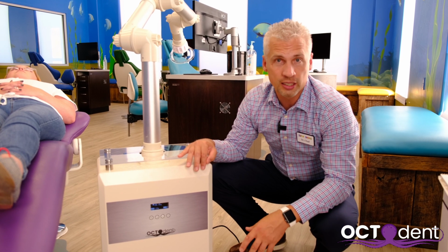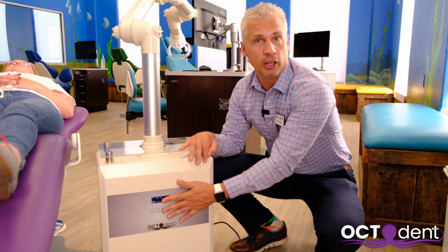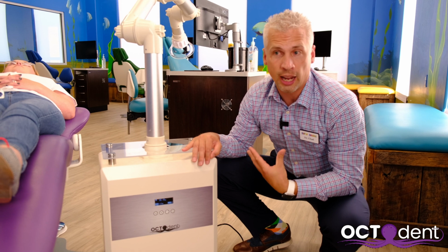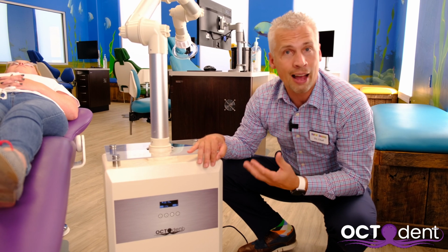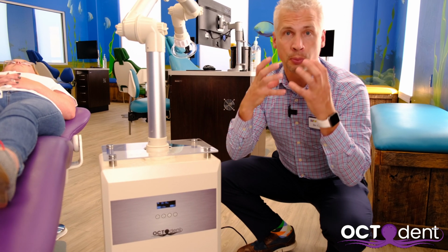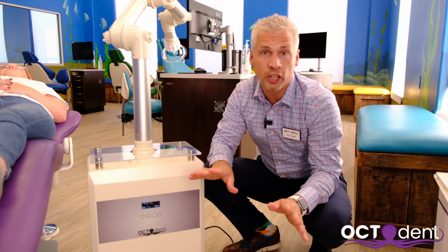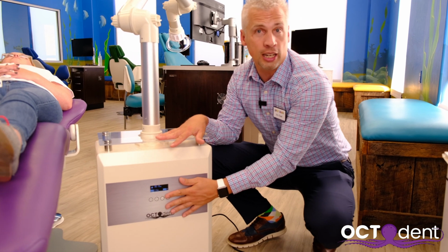The reason being is that if it's closely adapted to the patient's face, 4 is going to be enough. So if I'm a single operator, or I'm just doing air polishing or Cavitron, and I'm able to position it really easily next to the patient's face, I have a patient who's very compliant, they aren't moving around a lot, 4 is really nice for me.